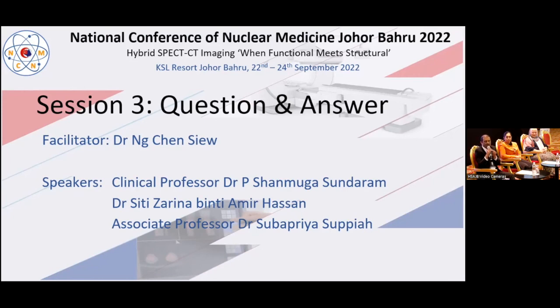In the delayed scan, if you are seeing a retention of tracer, retention of uptake in the superior or inferior pole of thyroid bed, then you are very sure. And that's where I personally feel doing a subtraction study will reduce the sensitivity. Let me explain why I feel like that.